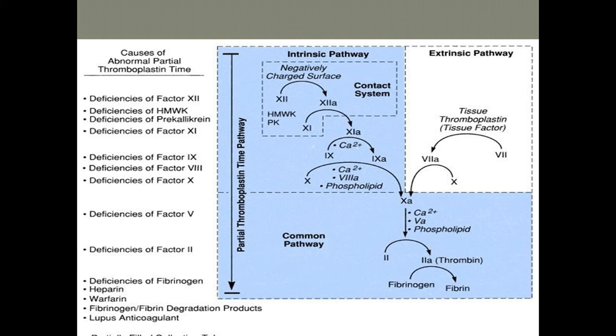We call this partial thromboplastin time because here in this test we are not involving this tissue factor. That is a part of the extrinsic pathway.